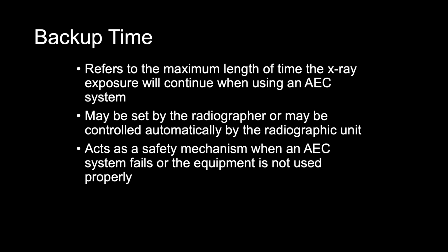The role of the backup time is to act as a safety mechanism when an AEC system fails or the equipment is not being used properly. In either case, the backup time protects the patients from receiving unnecessary exposure to radiation and protects the X-ray tube from reaching or exceeding its heat loading capacity, the maximum heat units.